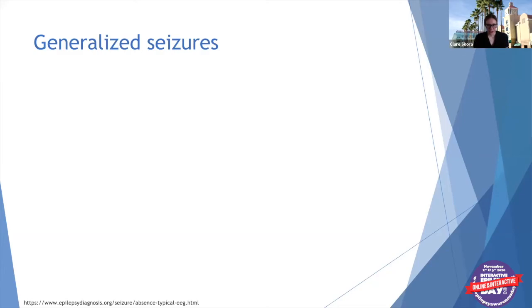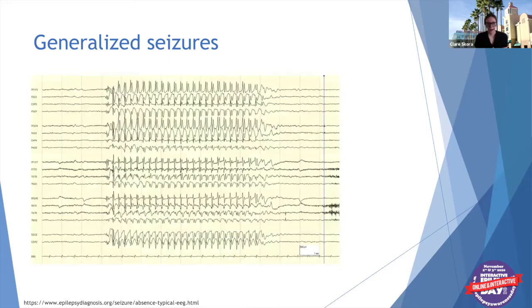And so now I'll go into just a little bit about what seizures actually look like on the EEG. Like I said, usually when we do routine 30-minute EEGs, we don't expect to get seizures, except in the case when we're suspecting absence epilepsy and we do hyperventilation and parents come in saying that their child has very frequent staring spells where they zone out. So this is what an absence seizure looks like on an EEG.